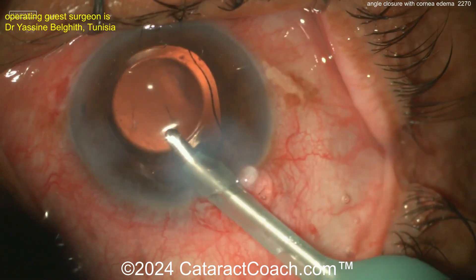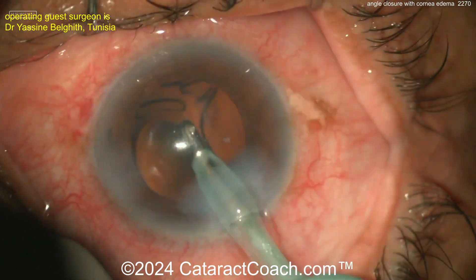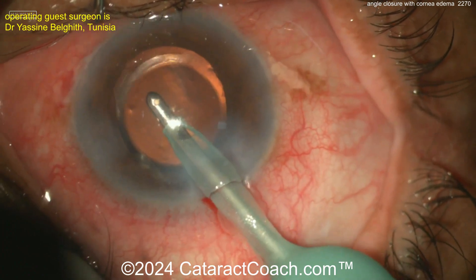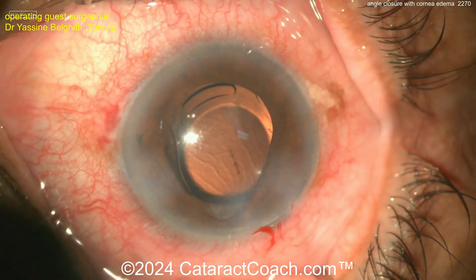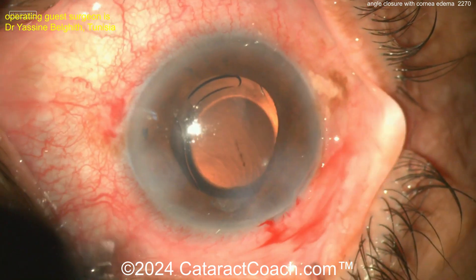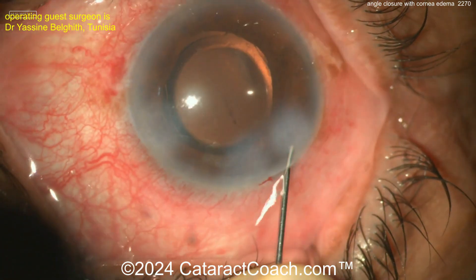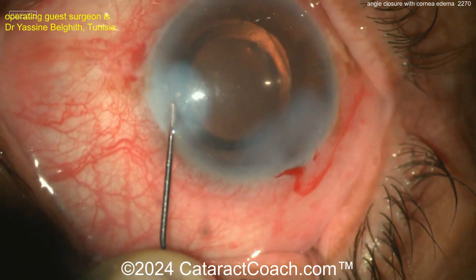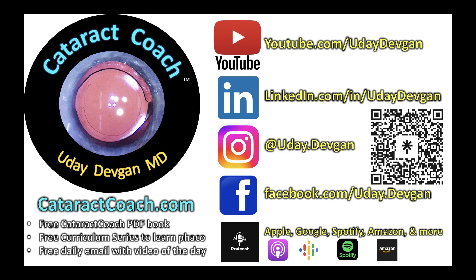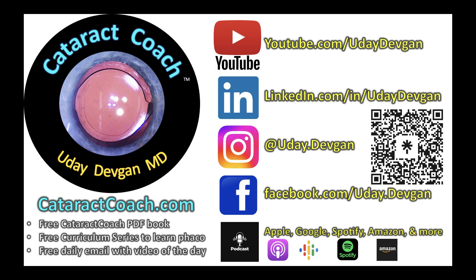The IOL is obviously much thinner than the cataractous lens that was removed. Put it into position, set it up nicely, remove all the viscoelastic — very important. Seal up the incisions, fix that little bit of iris prolapse, and we'll call this a day. That's a beautiful case and it really resolved all of the patient's issues. Check out the CataractCoach podcast every Sunday wherever you find podcasts.